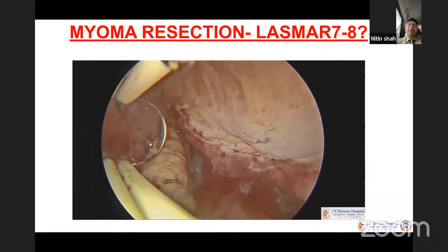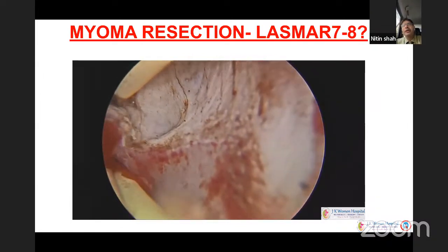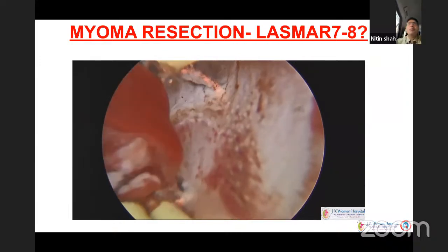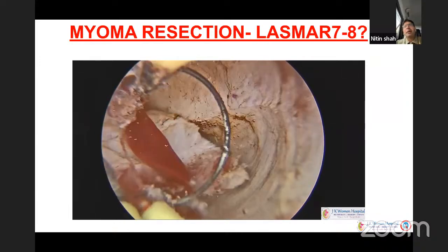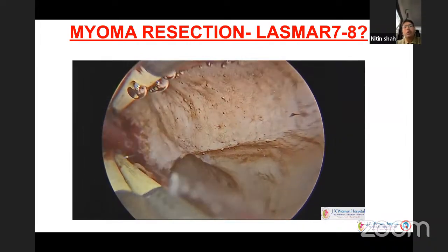A combination is better. You start hysteroscopically. If the angle between the fibroid and the uterine wall is obtuse, most of the fibroid is in the myometrium and above, so do a laparoscopy and try it. If it is more than 4-5 centimeter, remove it laparoscopically.